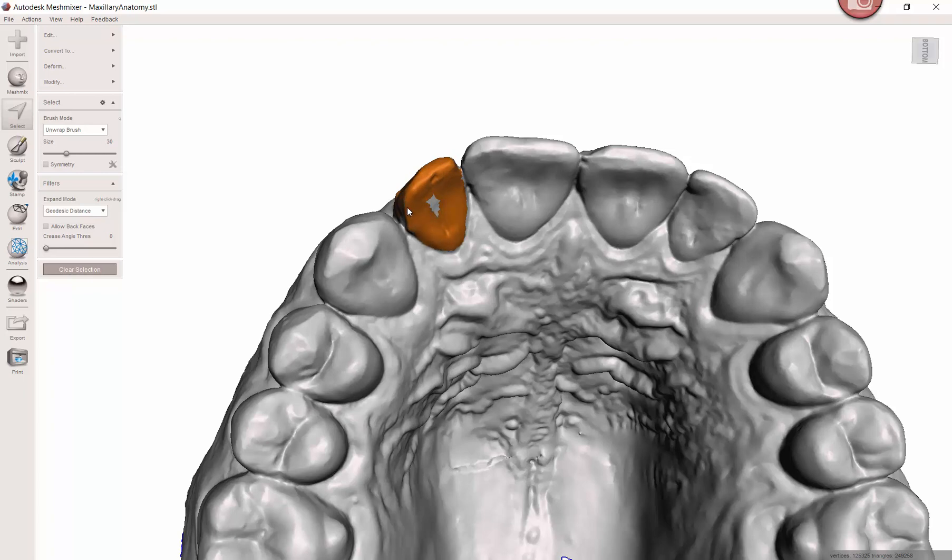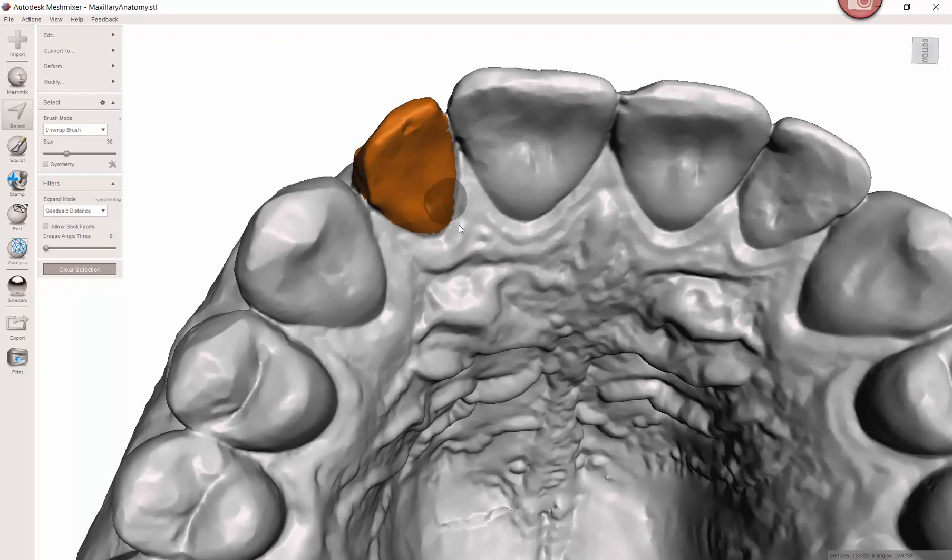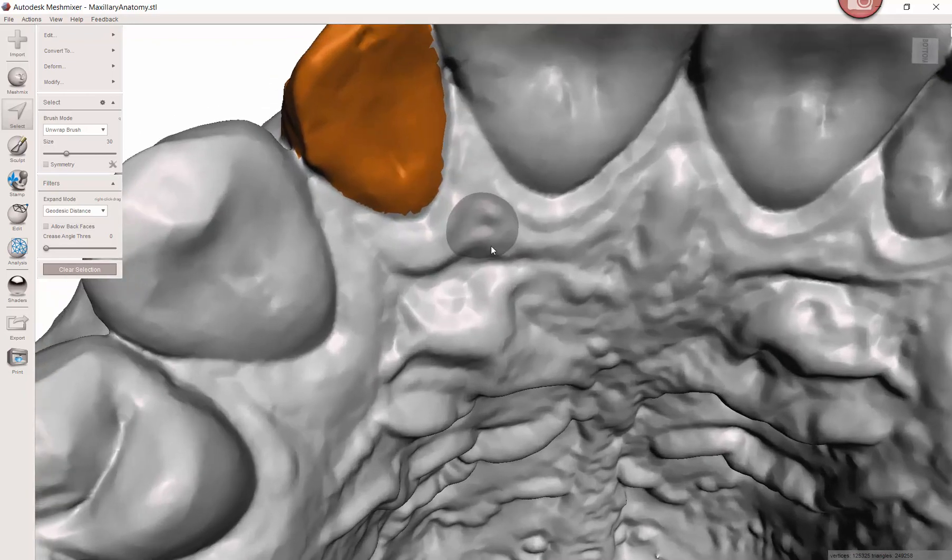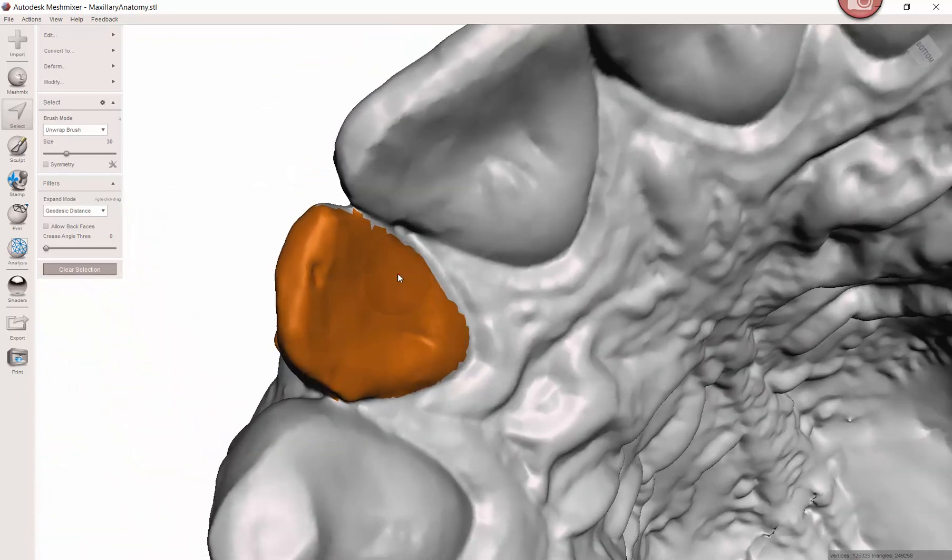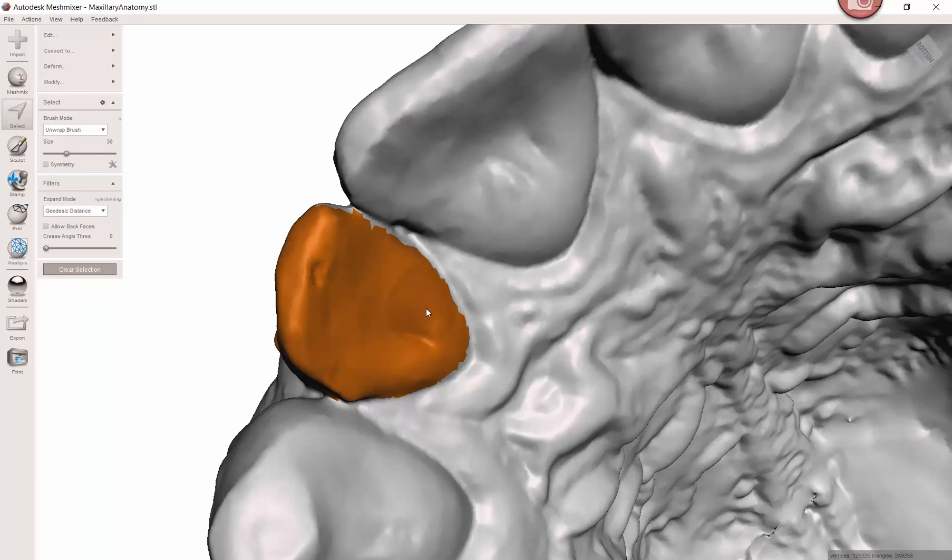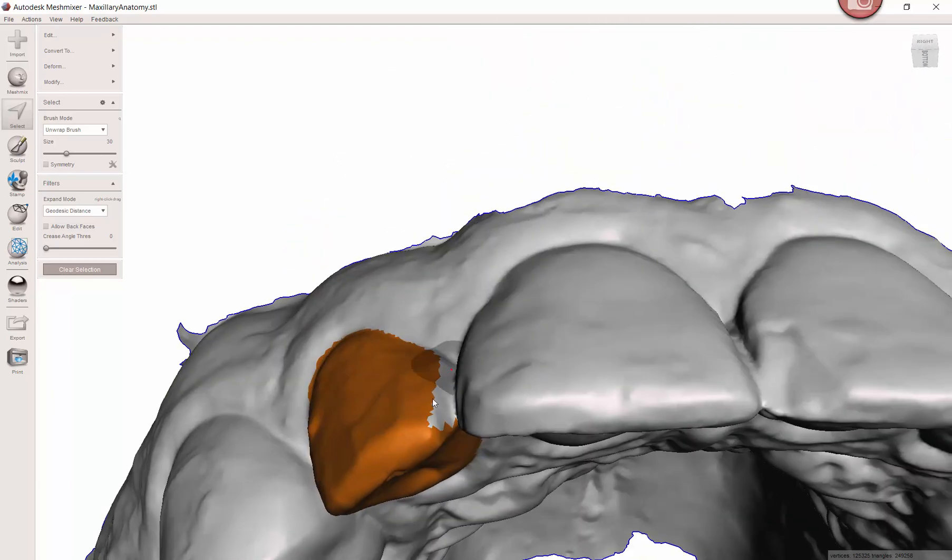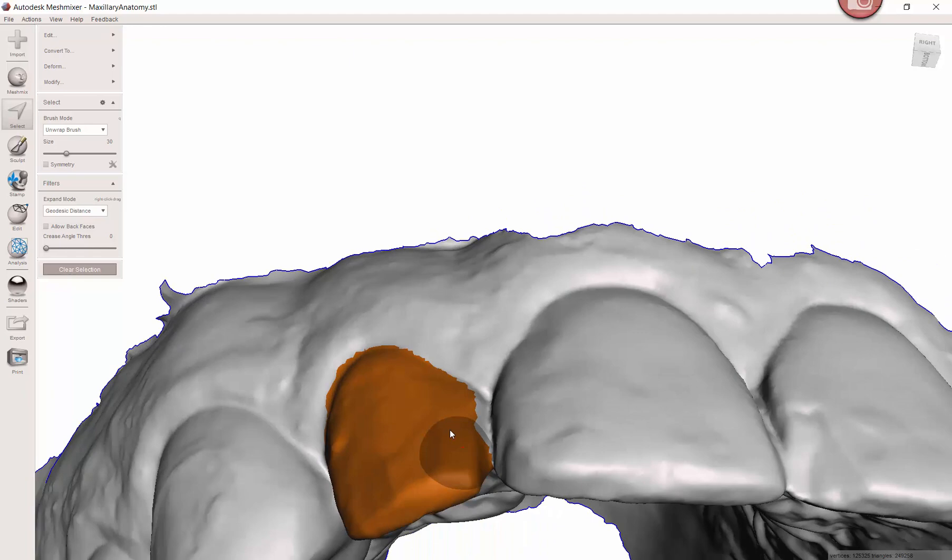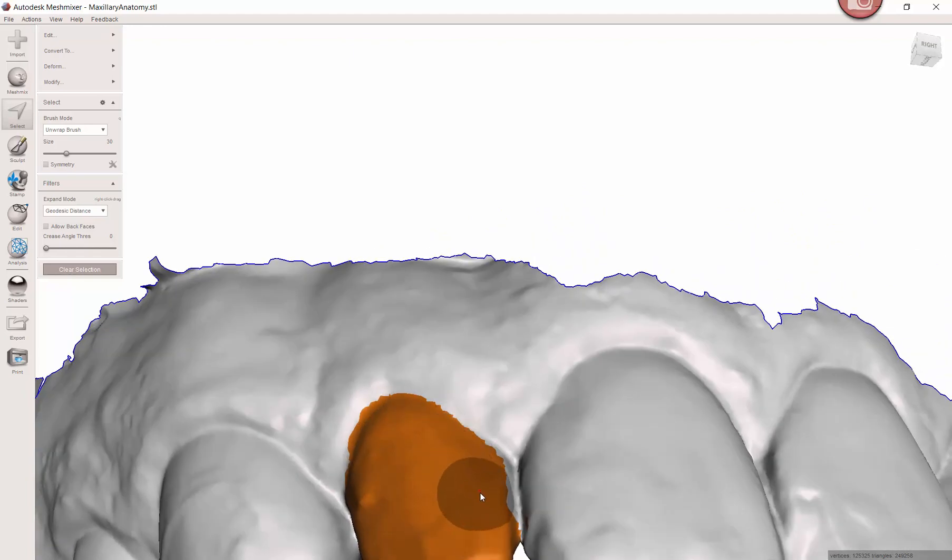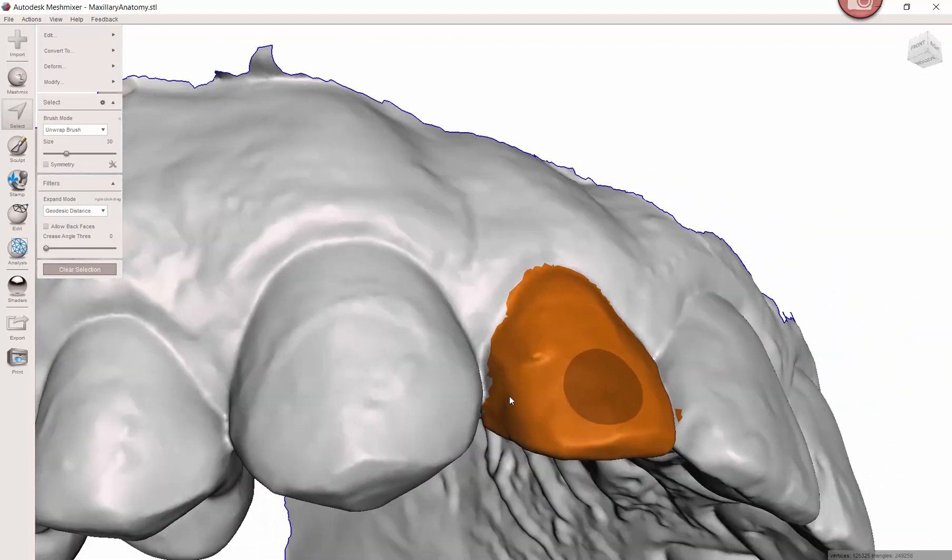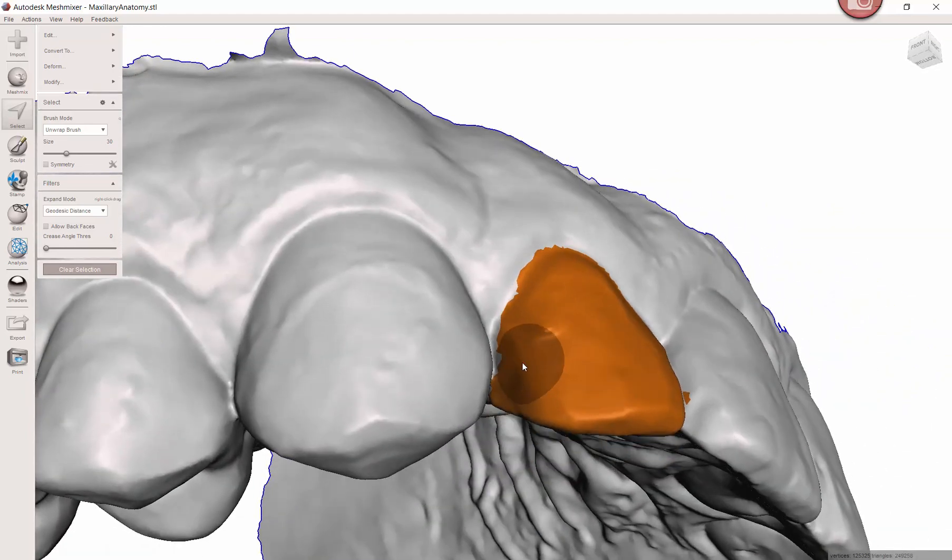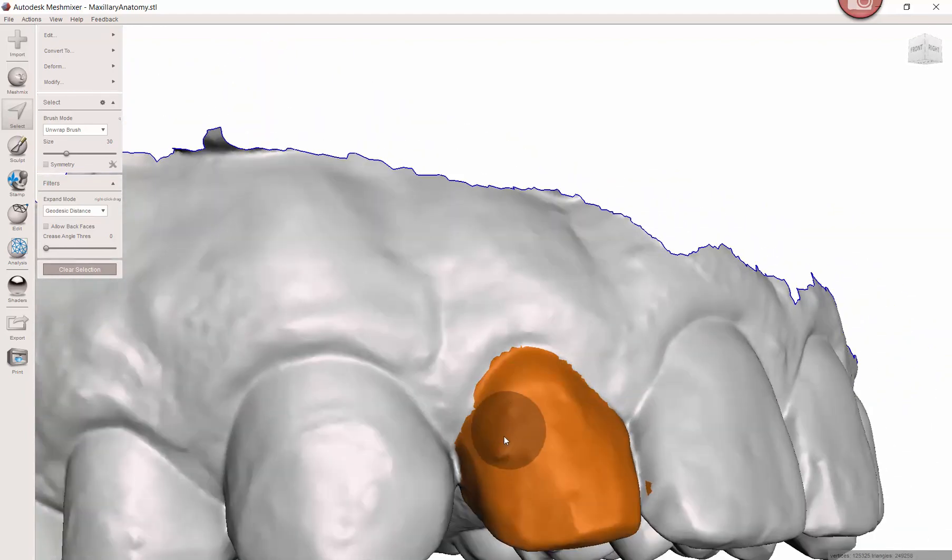Generally speaking, it's better to err on the side of leaving a little bit of the tooth. You don't want to accidentally virtually extract an adjacent tooth or part of it, because then whatever you try to fit in there may not fit because you haven't actually extracted that tooth or part of it.